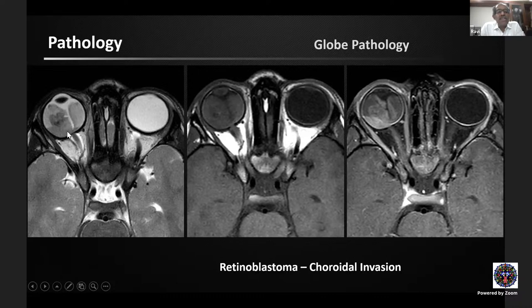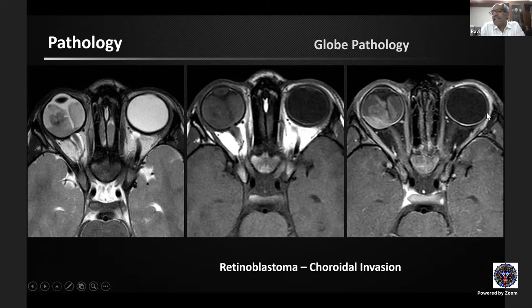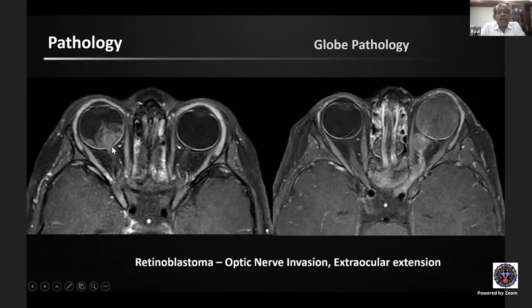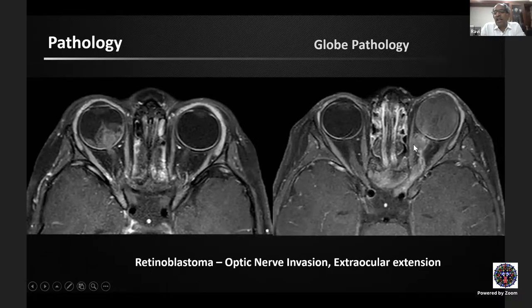In retinoblastoma, MRI reveals what CT cannot. The mass lesion is isointense to hypointense on T2 due to calcifications, isointense on T1, and enhancing on post-contrast study. Crucially, MRI shows choroidal invasion — normal choroid enhances up to a point in the right globe, beyond which it is absent, indicating choroidal invasion in this case. Focal retrolaminar optic nerve invasion of 2-3 mm, extensive optic nerve invasion to the intracranial compartment, and retroorbital fat extension are all clearly depicted on MRI.